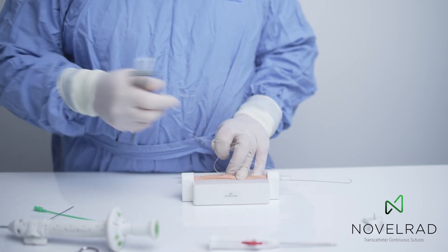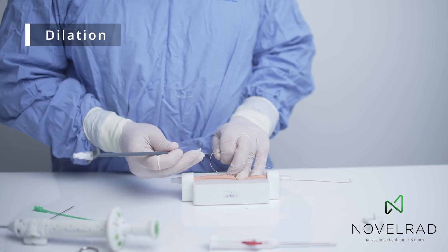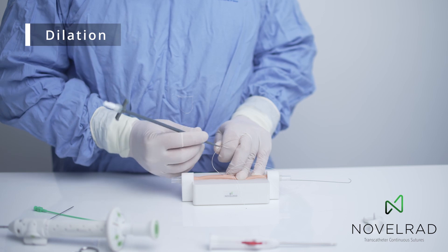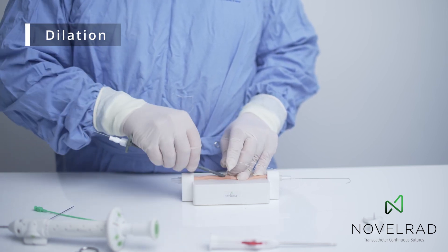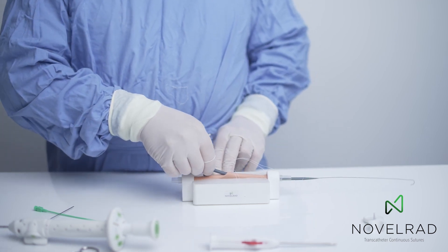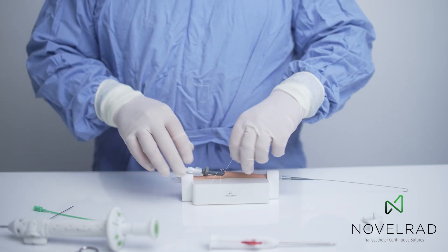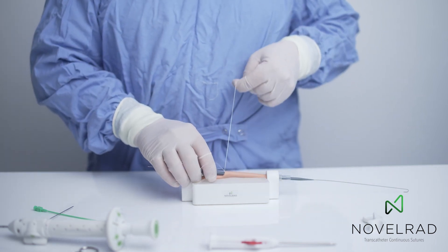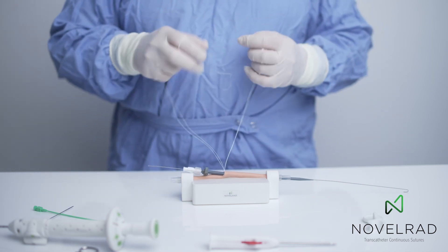In this demonstration, we're using a 14 French sheath — an introducer — but this can be dilated up to a much larger bore, even up to 30 French. TAVI would go through a 14 French, and here we're doing 14 French, which is almost the size of the vessel. You can see that the suture can be pulled around and tightened as it goes around the arteriotomy.